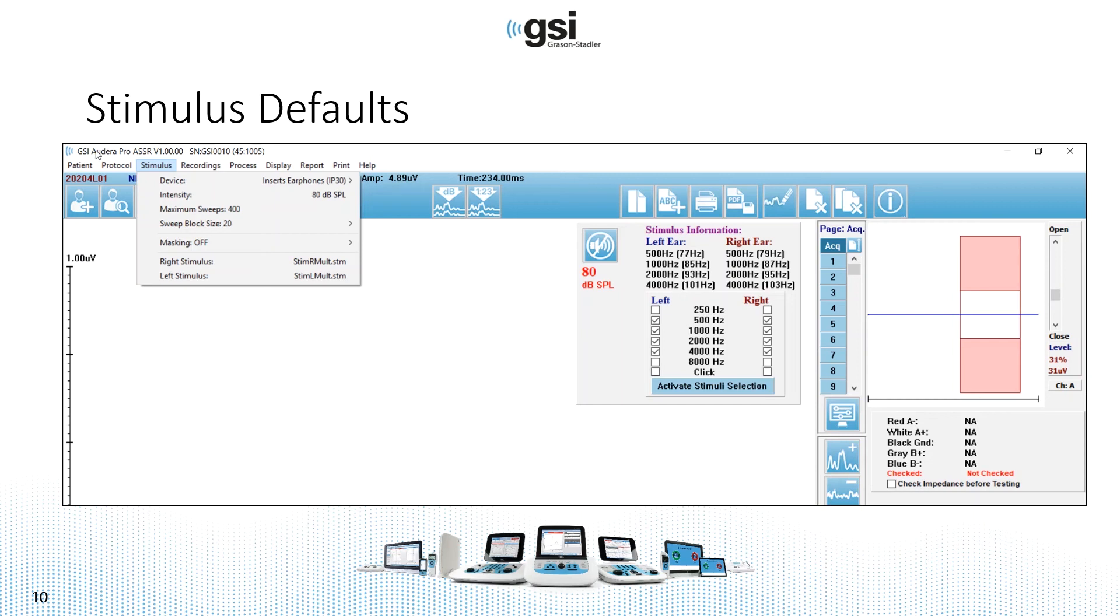And then block size. So ASSR data is collected using block averaging. The smallest block size available is 20. And so what that means is 20 sweeps will have to be collected before the test data is updated on your screen.